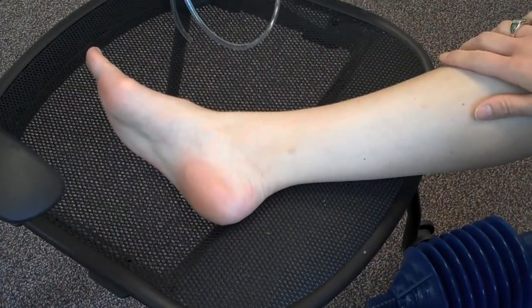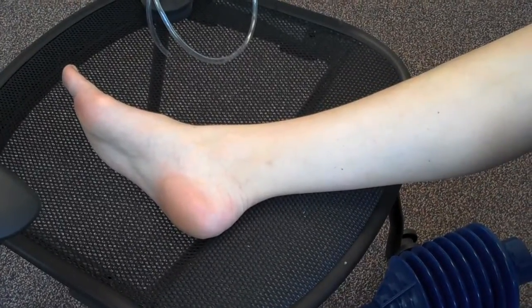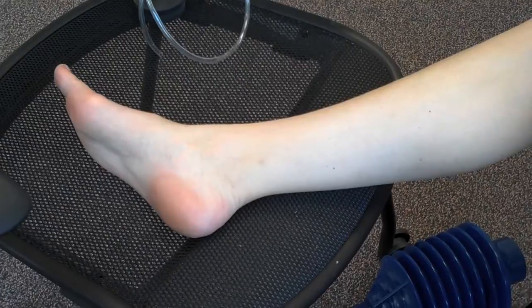Let me demonstrate the device on a clean area of skin, such as the ankle, a typical location of diabetic ulcers and impact wounds in Haiti.